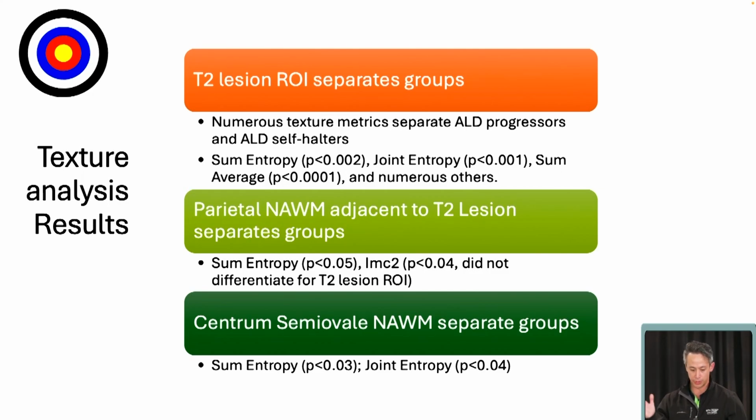And then there's also the relationship with age. But this may be a tool that we can test out, where just getting basic T1 and T2 MRIs, we can do this analysis. If somebody walks into the clinic and has an abnormal brain MRI, maybe they don't have any prior imaging, we can tell you if it's old or new, or if it's more predicted to stay stable for a while versus we think it's actually going to progress. So these are more clues to help guide our management.